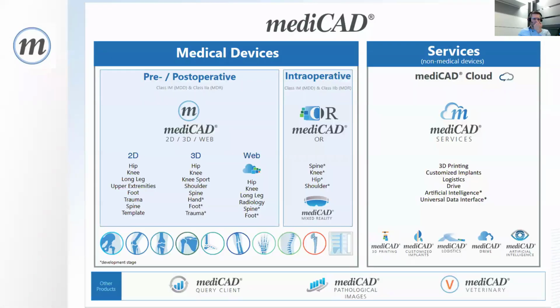Okay, for the first step, I just want to share my screen. I have a very short presentation. First of all, I want to tell you what mediCAD is about. This is a quick overview of our main modules or sections. The heart of our company is the pre-operative and post-operative planning.